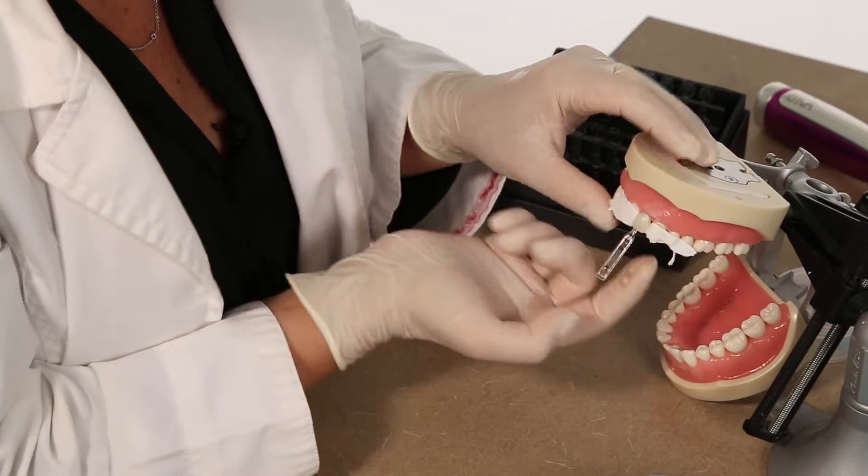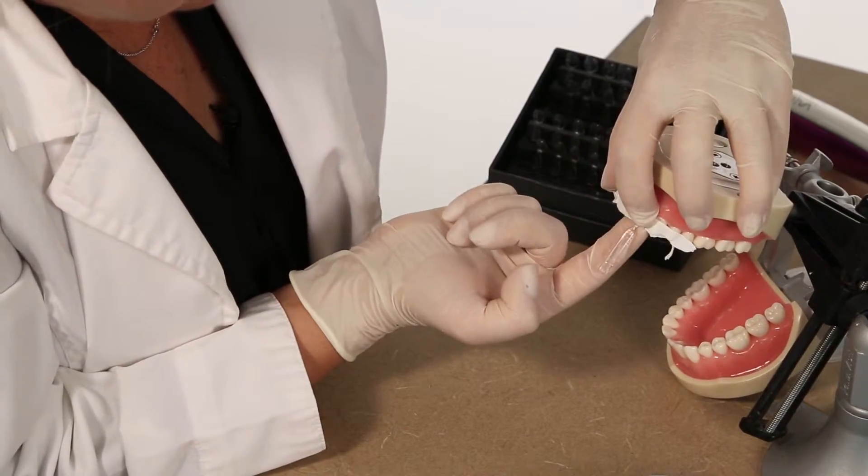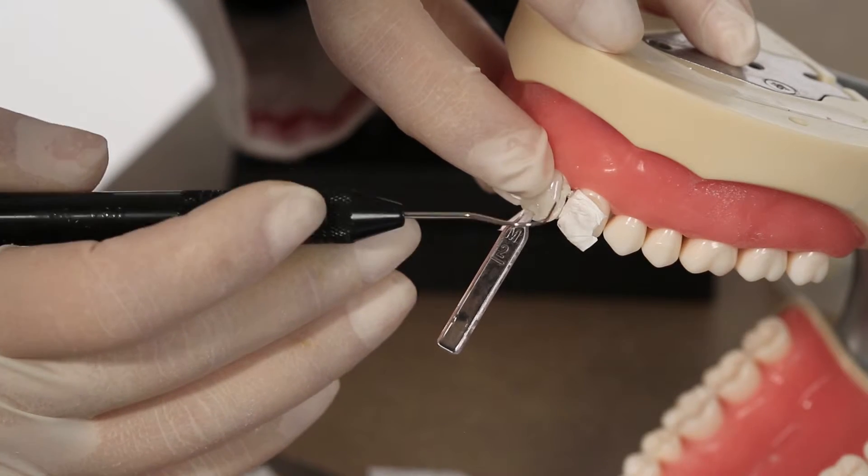Use your fingers to press the composite from the palatal side. Remove excess composite from the periphery with a probe.